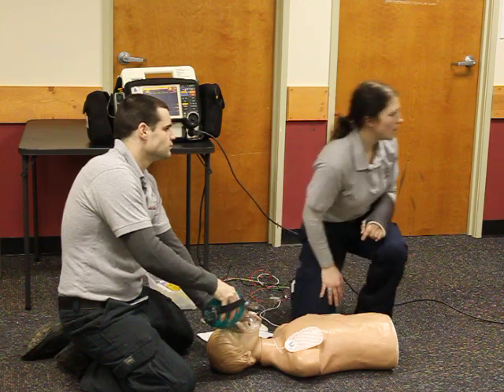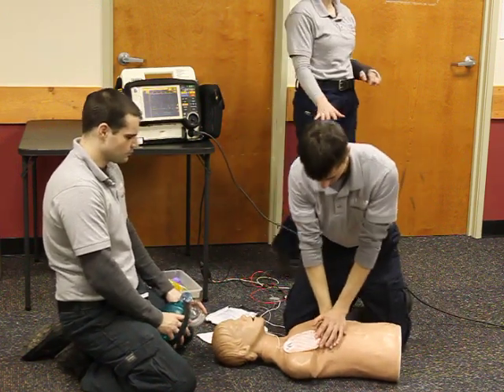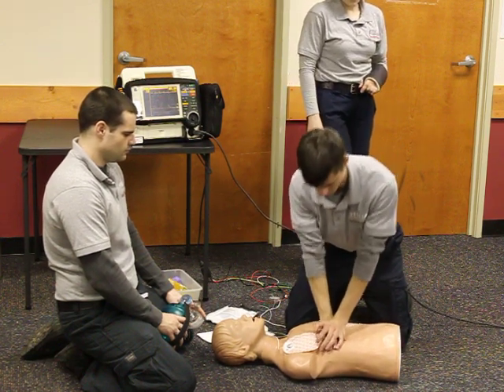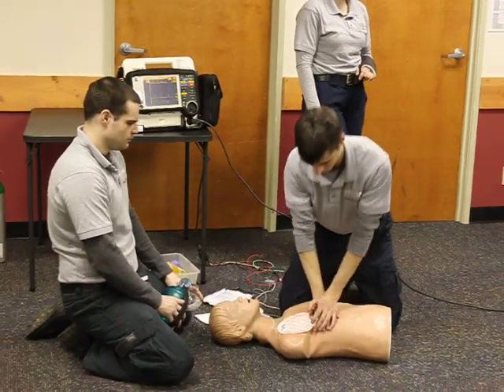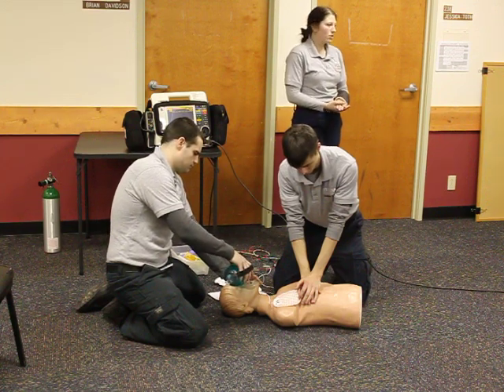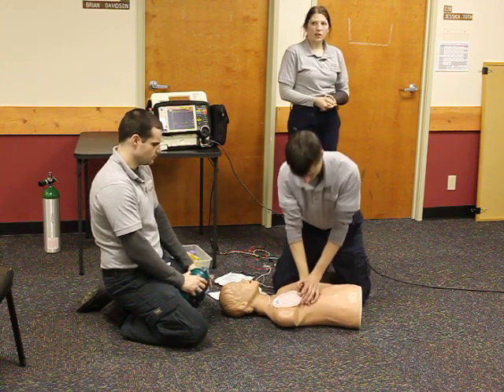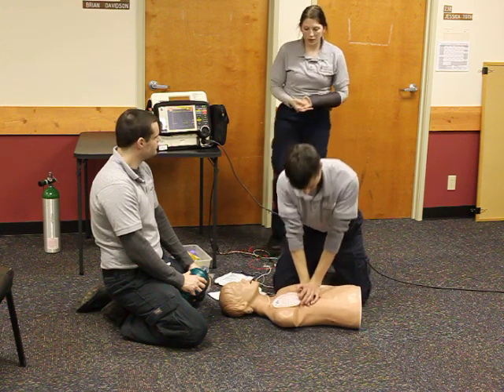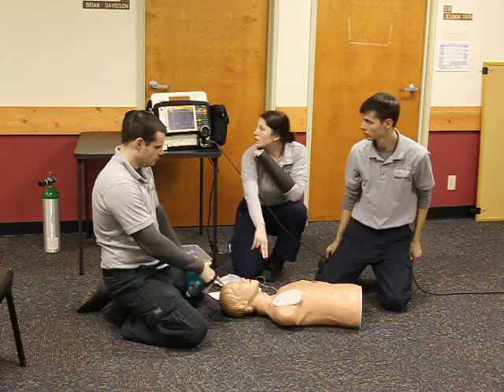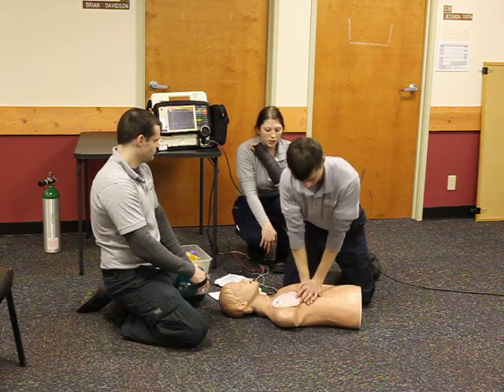At this time, I'm going to initiate CPR. I'm going to have my partners do CPR, 100 compressions a minute, with a rate of 30 compressions to 2 breaths. I'm also going to administer 1 milligram epinephrine, 1 to 10,000 IV, while they cycle through 2 minutes or 5 cycles of CPR. After 2 minutes, I'm going to stop, check for a pulse and look at the rhythm. Still no pulse. I'm going to continue CPR. We're still doing 30 to 2, 2 inches deep, 100 compressions a minute.